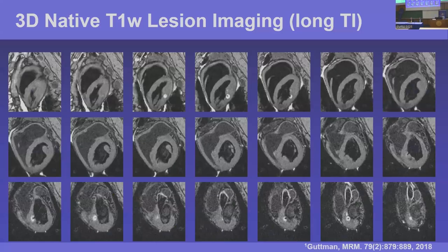The group at Hopkins, particularly Mike Gutman, really advanced this effort by turning the scan into a 3D scan, and now we can see these lesions really beautifully with this high resolution information to depict the target.